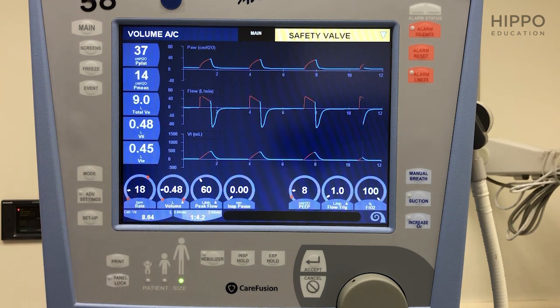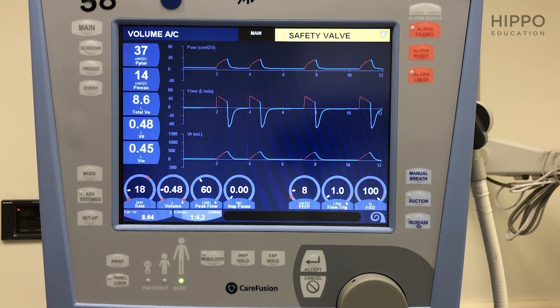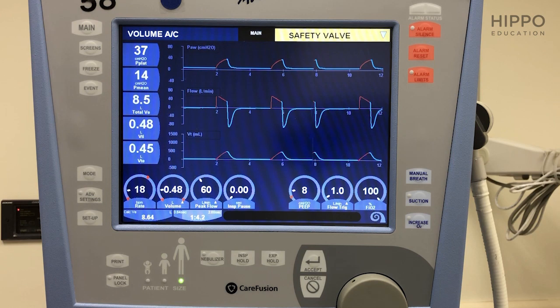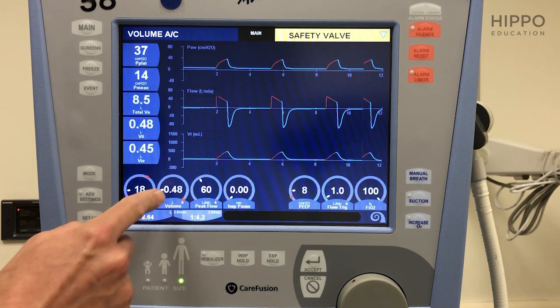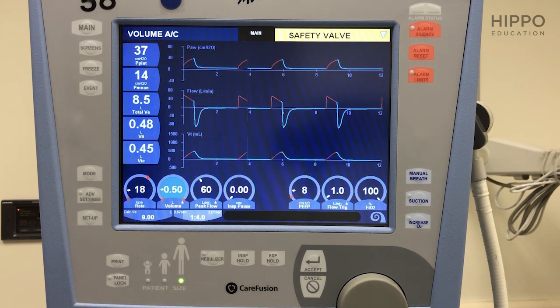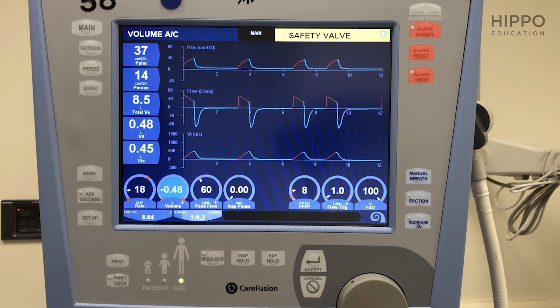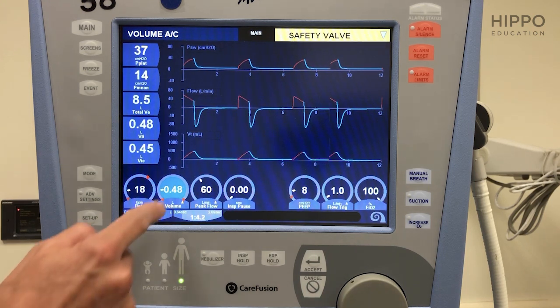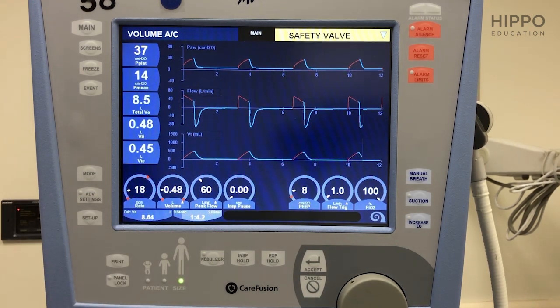The next one is tidal volume. For this patient, if we do our calculation — let's say it's a 60 kilogram patient and we're going at 8 milliliters per kilogram of ideal body weight — that would be 480. This machine would default to about 500 milliliters, but we want to go to 480. Toggle it down, accept, and move on.